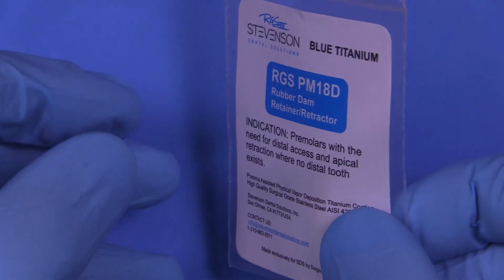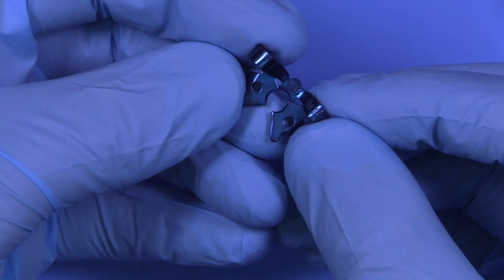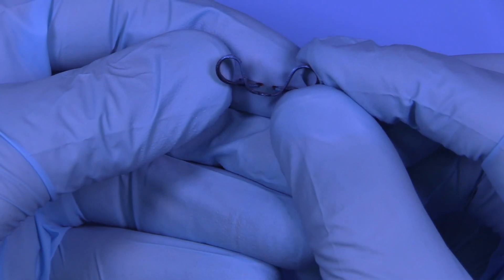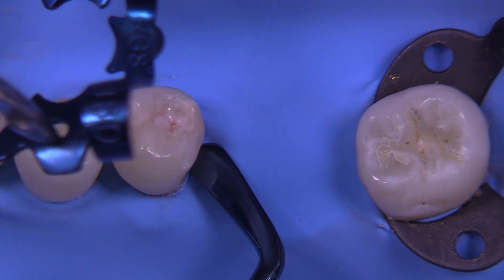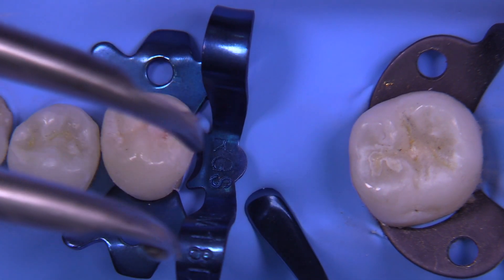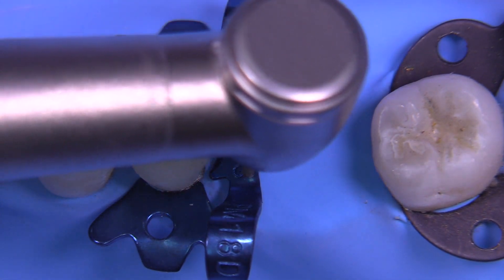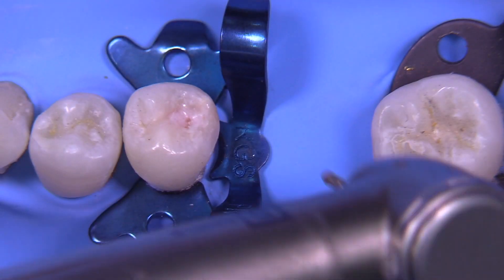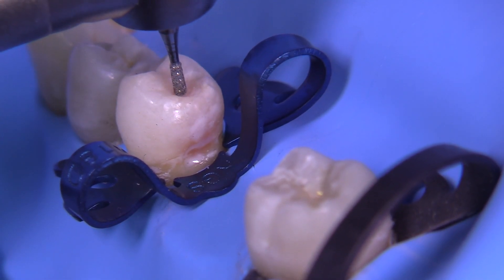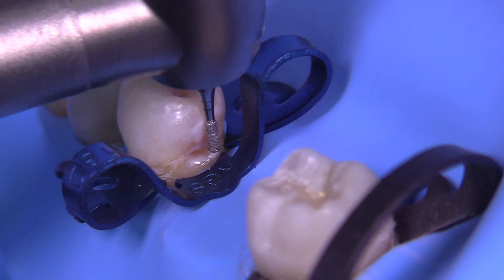I have a clamp that I've developed called the PM18D, and this is a companion clamp to the one for the molar which is called the 17. I'm going to hold this down with the plastic instrument and position it. Sometimes that distal bow will not engage the tooth — it doesn't really matter; if it does, great, if it doesn't, that's okay — it just needs to be stable. But look at the access you have; it's remarkable.